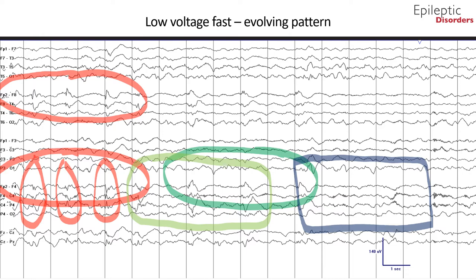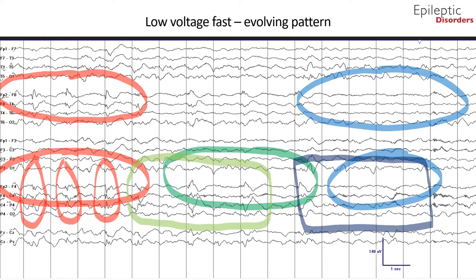This brings us to the concept of post-ictal slowing, which is most obvious over the right frontal regions as outlined in the blue circle. Post-ictal slowing is defined as abnormal slow activity or suppression with amplitude less than 10 microvolts within 30 seconds of seizure cessation, lasting more than 2 seconds.